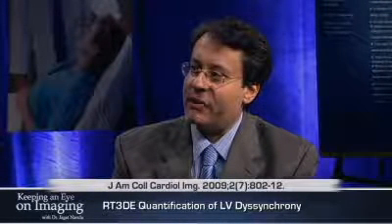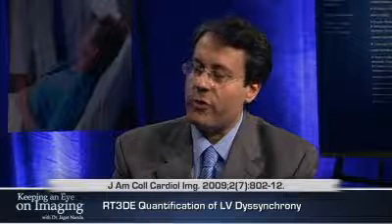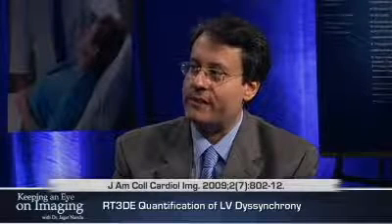Standard deviation is affected by a single outlier. So perhaps other analytic approaches where they look at not simply whether one segment is delayed compared to other, but how many segments, how they are clustered, and possibly also how much of a delay you're looking at as opposed to just one is delayed more than the other.